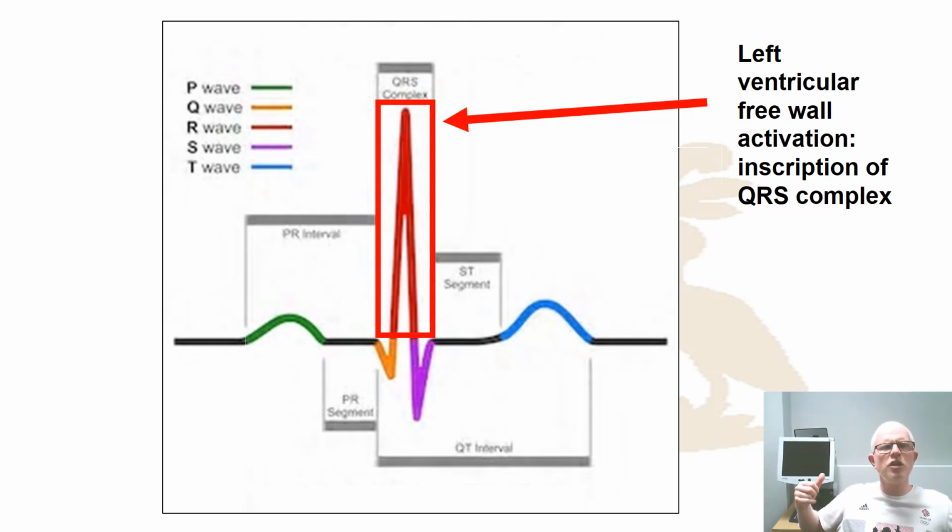The left ventricle is fundamental for the delivery of the oxygenated blood to almost all the regions of the body. Not all of them, but almost all the regions of the body. It requires an incredibly forceful contraction, so you're going to get very, very high neural innervation in order to drive that. So high electrical discharge is going to be required to drive that ventricle recruitment. So you get a very high signal in the ECG trace.